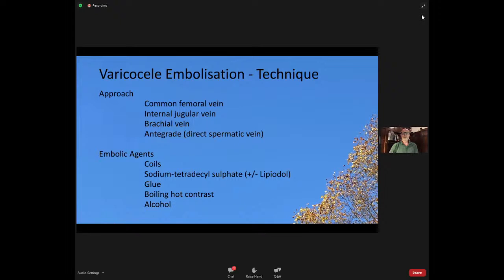Again, you can get quite animated debates around the embolic agent that people choose. Coils, again, traditionally the most common. Foam sclerotherapy, I would say increasingly used, and certainly in our center. I think the lower three have been tried and published, but I wouldn't see those as being embolic agents that we would consider appropriate for varicocele embolization.